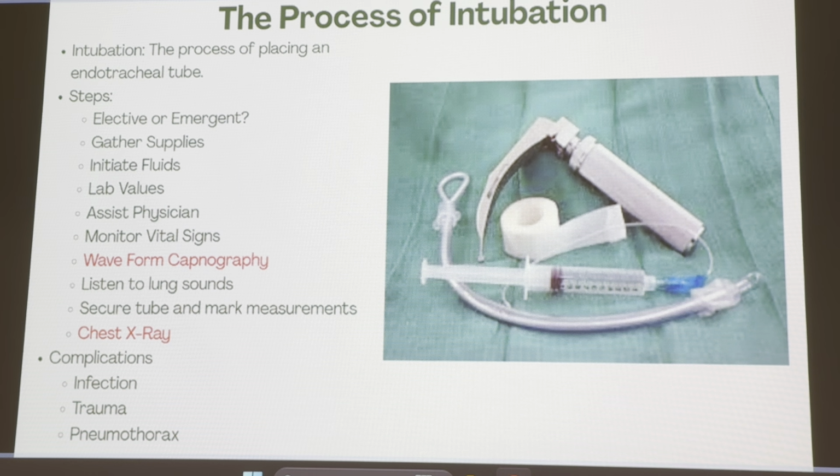So if it's elective or emergent, we gathered all our supplies. Remember, we initiated those fluids, that normal saline, just at a steady, continuous drip. We're not really putting it on a pump. I told my physician the lab values, so he knows those. Now, what is my role as a nurse during intubation? Monitoring vital signs. What else? Anything? Lung sounds.